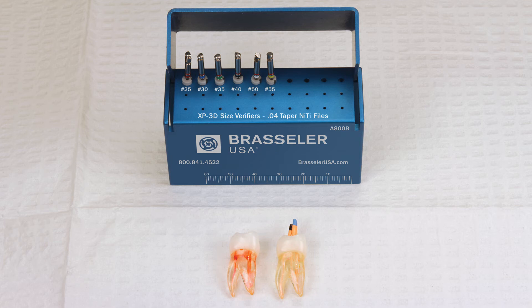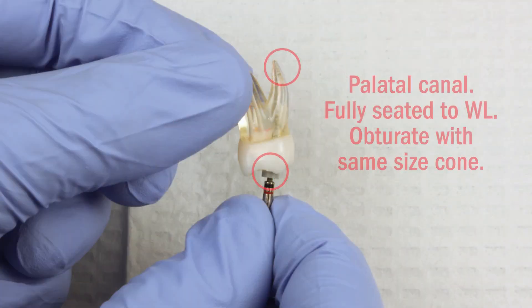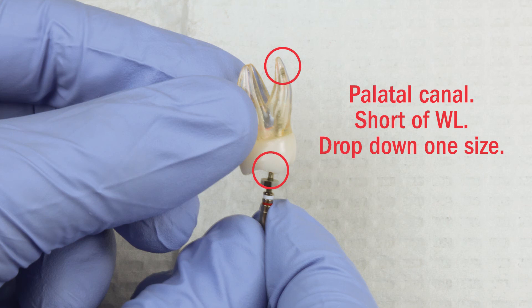There are several methods for achieving this, including gutta-percha trimming. A very popular method is to simply use your old NITI files as apical verifiers in your fingers. You can reuse these verifiers countless times as they're not undergoing any real stress. If you come up short, you simply drop down a size.